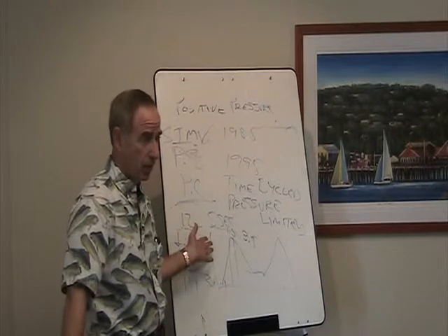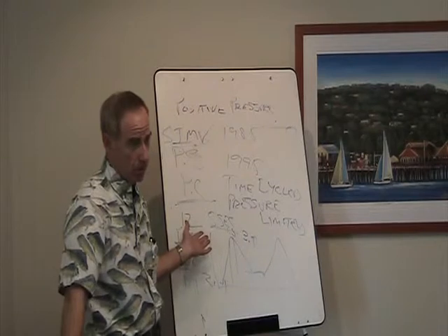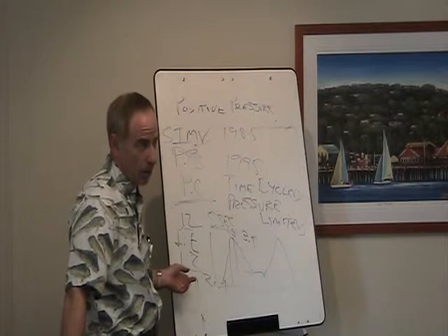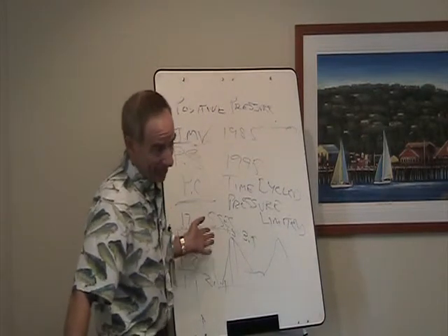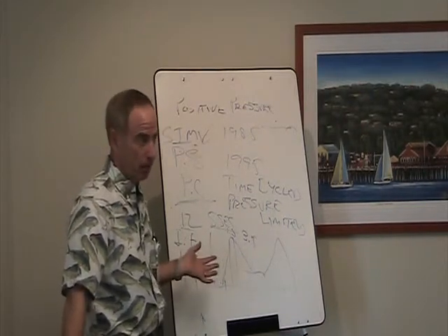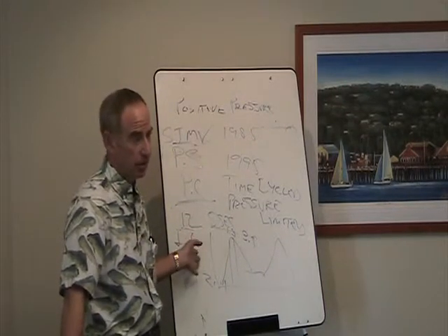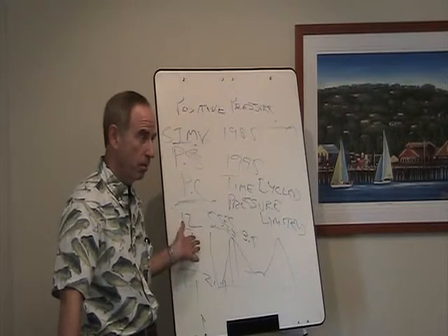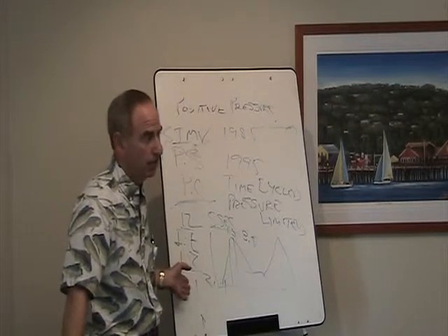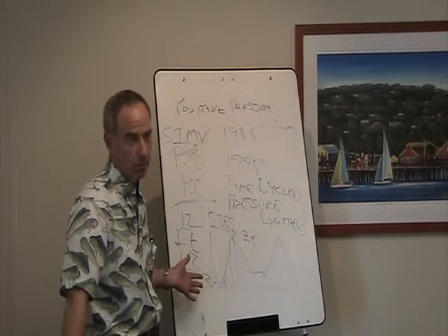So the problem with this kind of ventilation is it's not very comfortable, right? Because you're not used to having a 2 to 1 IE ratio. That means it would be like holding your breath for a second or two and then letting it out. That's a very abnormal way to breathe, and it's very uncomfortable for patients. So most of the time in pressure control ventilation, you need to really sedate them heavily or even paralyze them if you're going to be using these different IE ratios. And why would you ever want to use that? To allow more time for oxygen exchange.